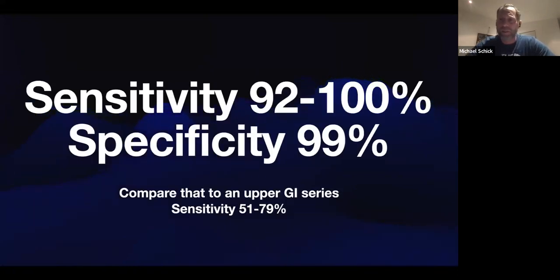Now, ultrasound is also really an ideal modality to make this diagnosis. I think it's really underutilized. Sensitivity is really good, as well as specificity. We used to do a lot of upper GI series in these patients, but you can see that the sensitivity is not as good.